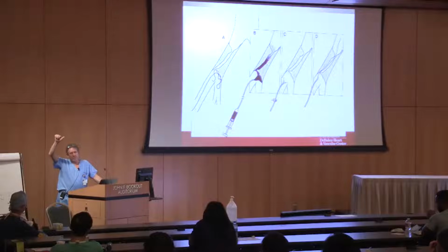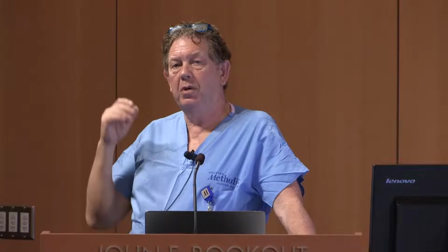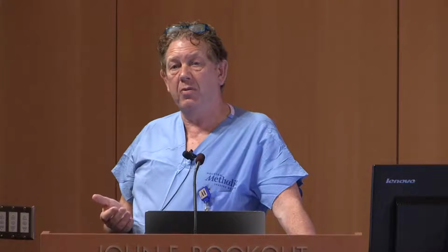So the 3 words are time, and that's one of the things you really need to learn when you start off doing this. It's pretty hard because you're focused on learning the components of the procedure, and you may or may not be trying to run the radiation at the same time. I was thinking like Ringo Starr up there. You've got both hands and a couple of feet basically going, try to make this work. And what happens is you end up stepping on the fluoro pedal and staying on the fluoro pedal, and your attending is saying, get off the fluoro, get off the fluoro.